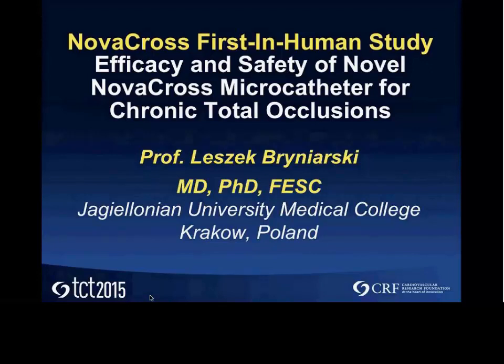No, I think this was a wonderful case. Congratulations on a very well done case, and great result in the end, and great demonstration of techniques. Couple of thoughts and questions. I know it was a single major collateral branch coming from the apex to the PDA. Did the patient have any chest discomfort or ischemia during the procedure, or did he tolerate crossing the collateral pretty well? Very, very well. He told us that there is some discomfort, but only small discomfort, not typical pain. So it was very comfortable for us to work with this.